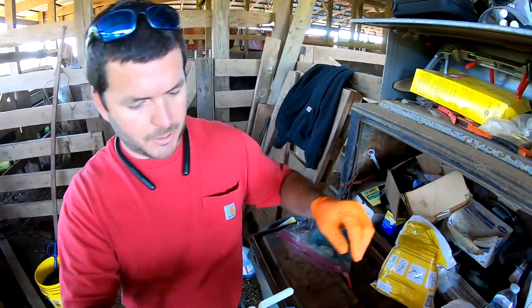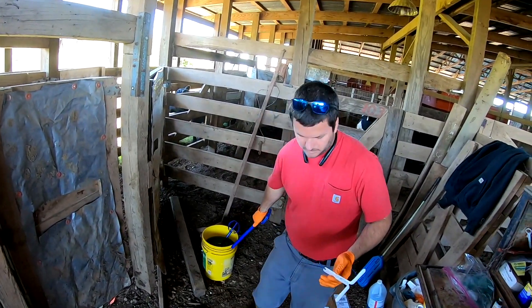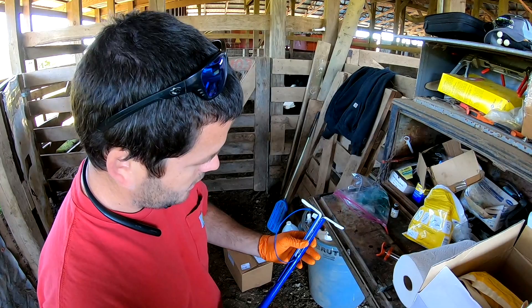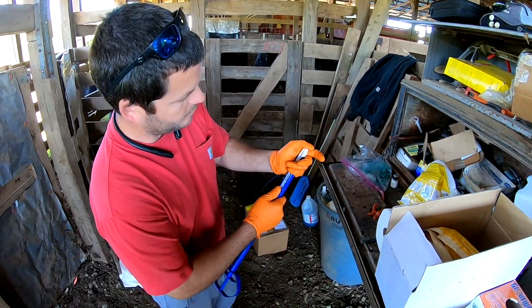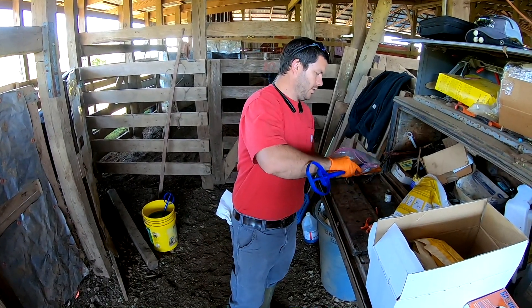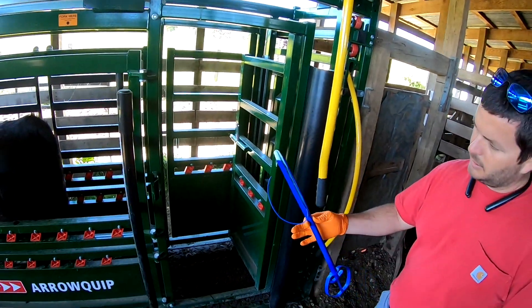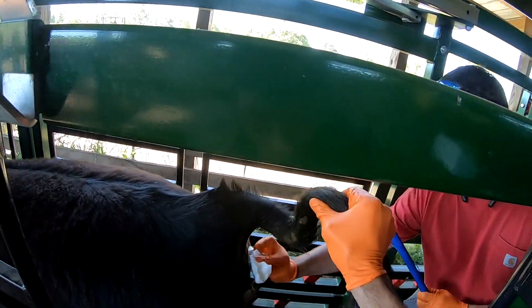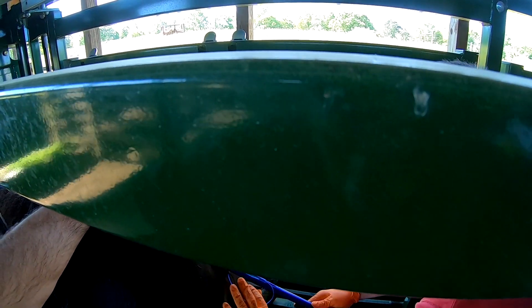So this is one of the CIDRs that we're putting in — some progesterone. You take your applicator, and what we have found according to the directions: you have a button, put that button down, wrap the string down and underneath, slide it into the applicator, get the big tip in, and put lube on it. That's what it looks like before you apply. You always want to make sure the vulva and vaginal area is positioned so you can put it in at a 30 to 35 degree angle.